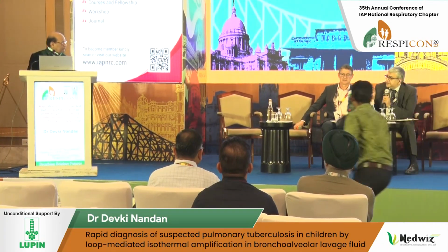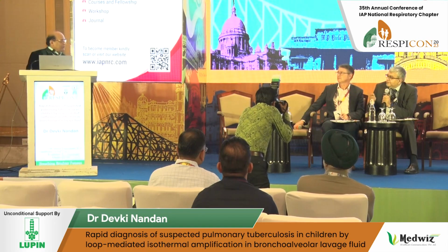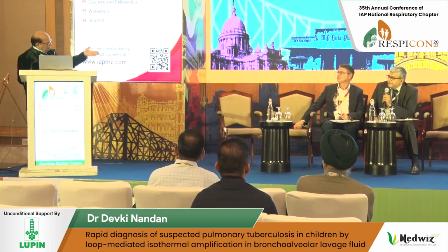I had another operational question. How easy is it for centers to learn this technique? The LAMP technique is very simple. It is also approved by the WHO in 2016, and this is available for sputum and for gastric aspirate at peripheral centers.